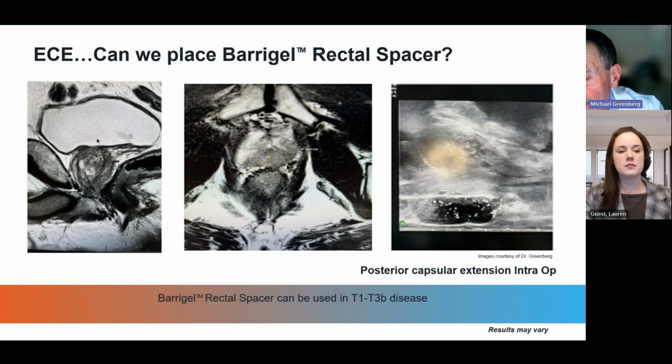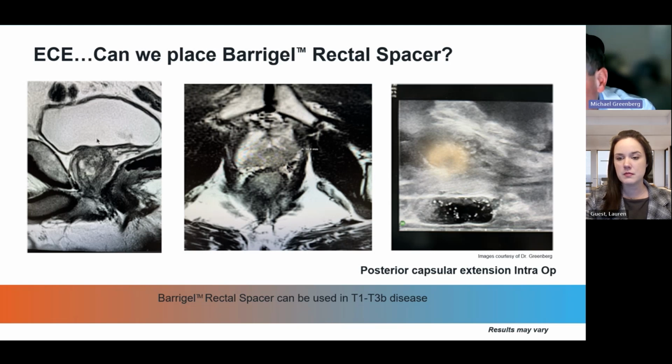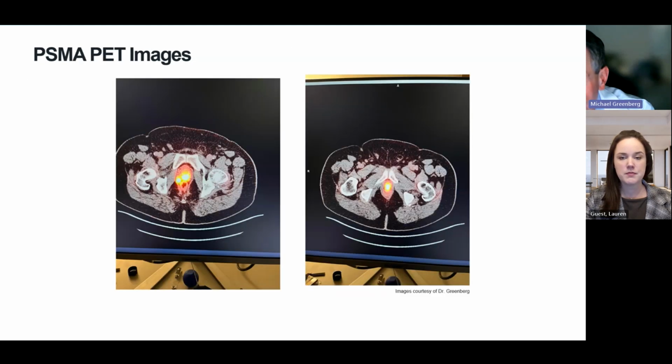And the final slide is the intra-op case during the procedure. It's so much fun to look at that because you can see how much lift you got and how symmetrical that was, lifting the capsule completely off of the anterior rectal wall by well better than a centimeter, probably 1.5 centimeters. Again, this was done under local.